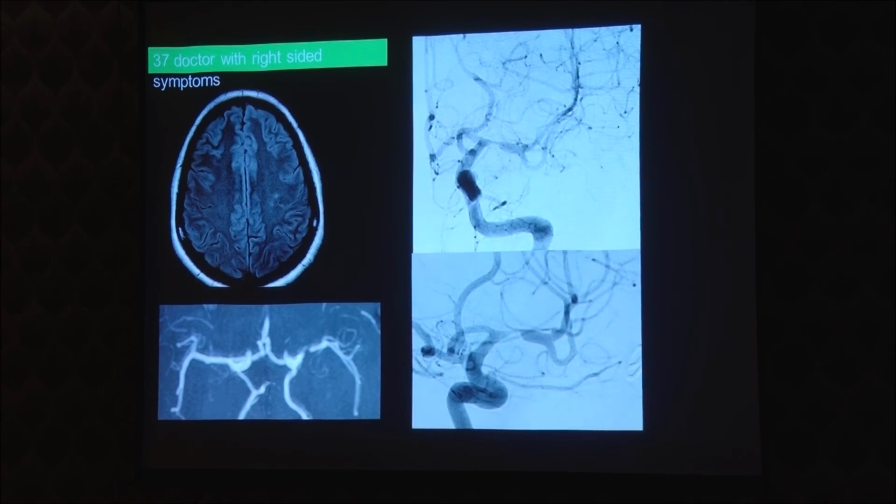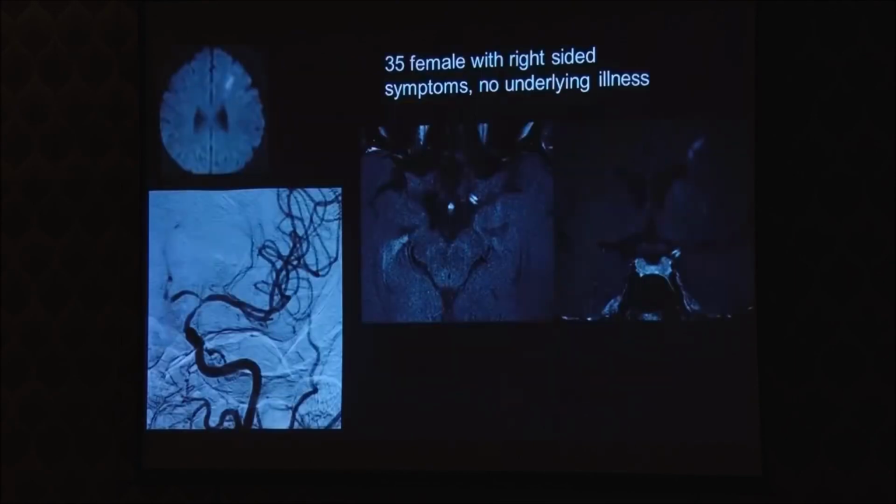This is the DSA picture here. If you see here on T1 post-contrast imaging, you clearly see the fibrous cap enhancing, and it's an eccentric wall thickening and enhancing eccentrically, grade 2 enhancement. This points to an atherosclerotic disease.